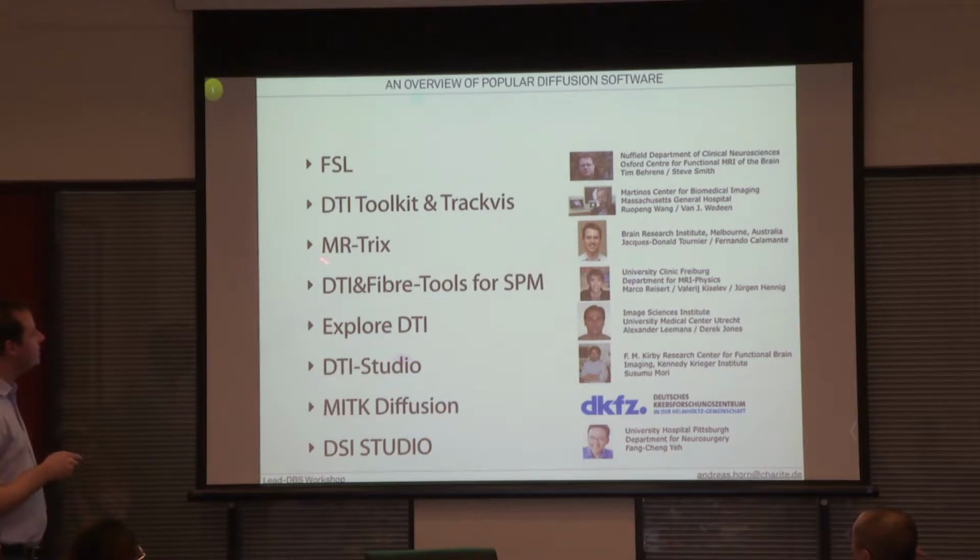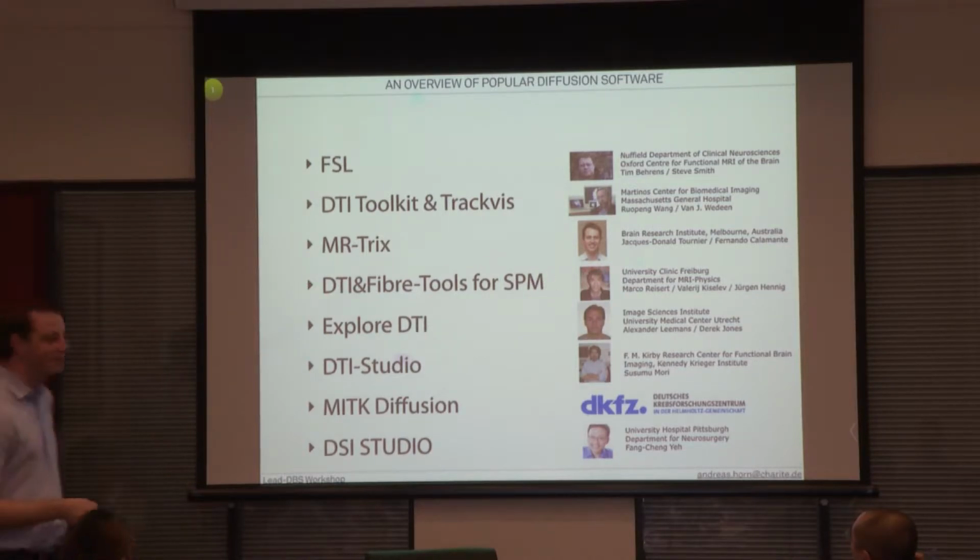Then I think under maybe the more expert people, MRtrix is really popular. So a lot of people that are only doing diffusion MRI tell me it's the best software. I don't know if it's true, but it's actually pretty good. Also nice visualizations and so on. Then this is a really outcast. This is the Freiburg data that I just showed you. So nobody uses this except me.